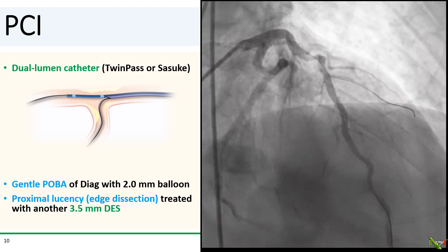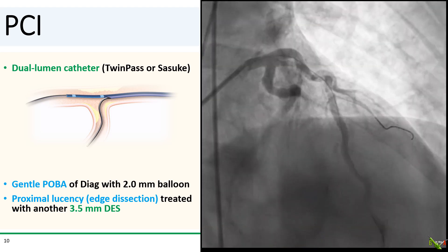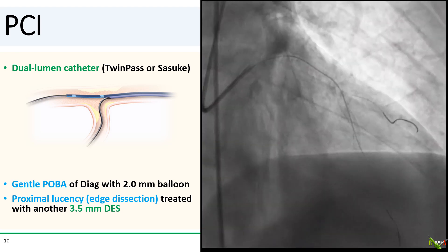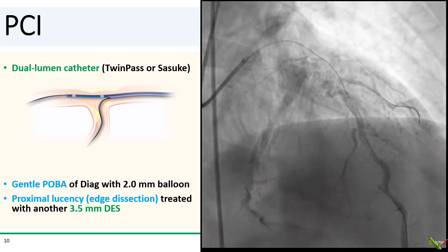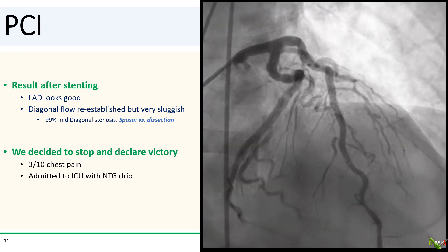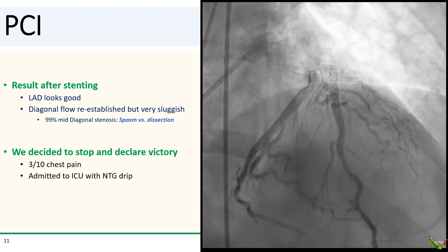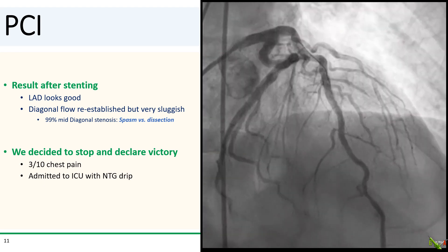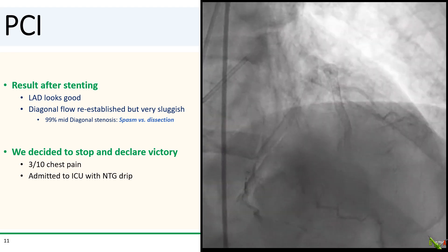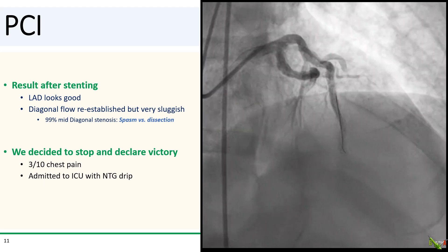Once the diagonal was wired, we gently dilated it with a 2.0 balloon. There was a lucency in the LAD just proximal to our previous stent, which we stented with another 3.5 mm DES. After stenting, the LAD looks good. We got flow back in the diagonal, but the flow is still very sluggish, and it does look like there might be a focal dissection or severe spasm in the mid-segment of the diagonal. We gave nitro, but that really didn't do anything. Her chest pain was getting better, so we decided to stop and declare victory.